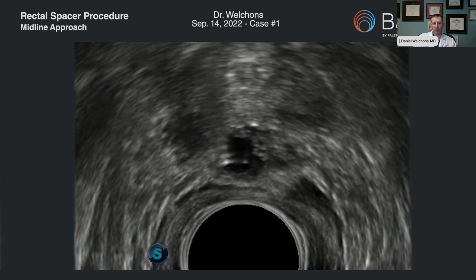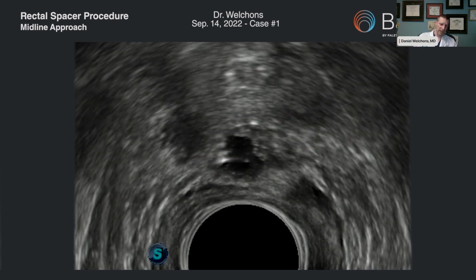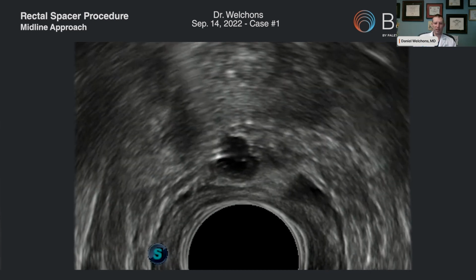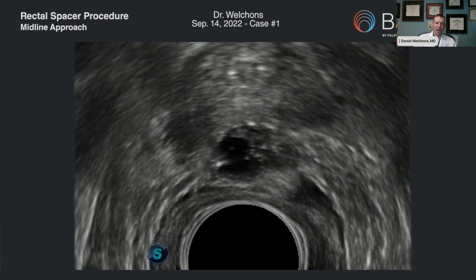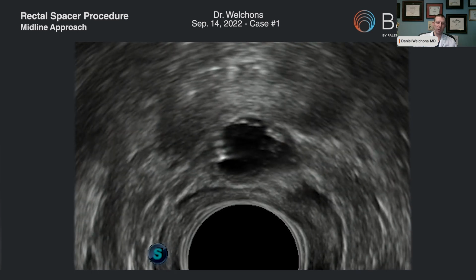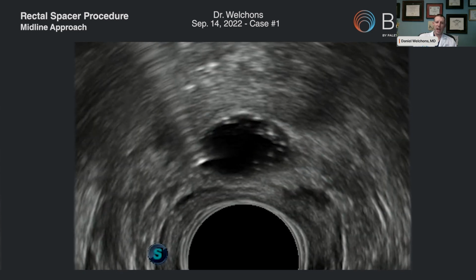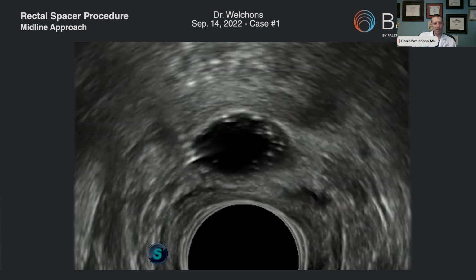I'm moving a needle because I want to try and get the gel to go over to the right side of the prostate or the left side of the prostate. And you can do that quite easily with Barrigel. And kind of the interesting thing about it is that the space stays. So you inject the gel and you get it to the place that you want. And then when you remove the needle, the space is still there, which allows you to make pretty good progress in that you can inject and then move on to another place, and it just opens up.